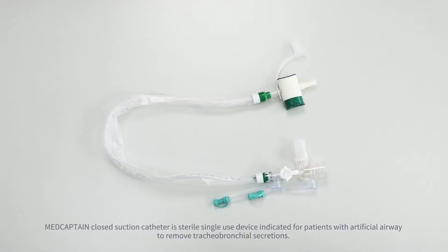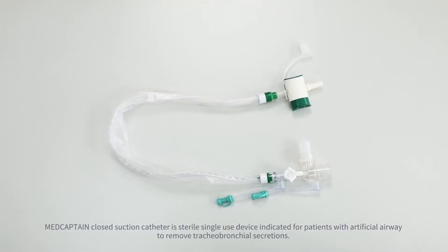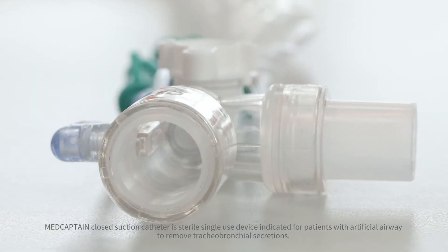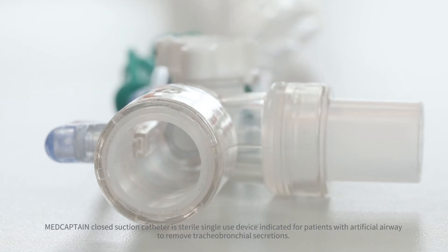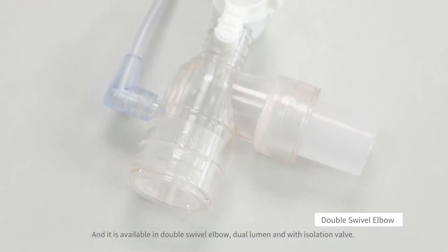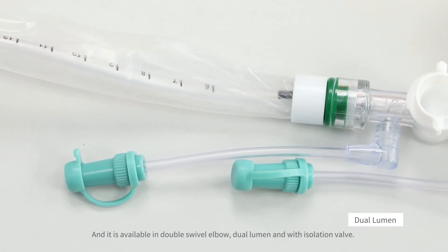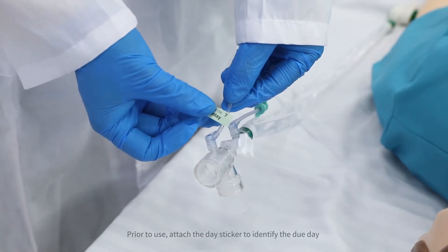MedCaptain Close Suction Catheter is a sterile single-use device indicated for patients with an artificial airway to remove tracheobronchial secretions. It is available in double swivel elbow and dual lumen configurations, and with an isolation valve.